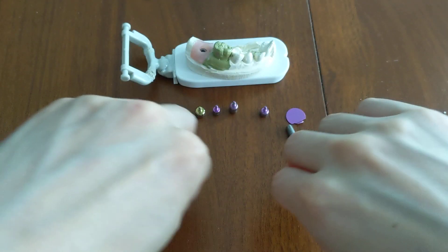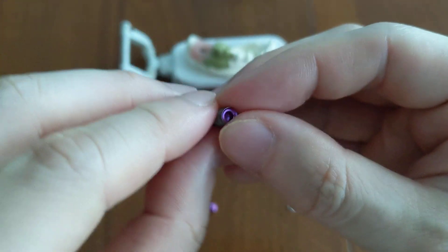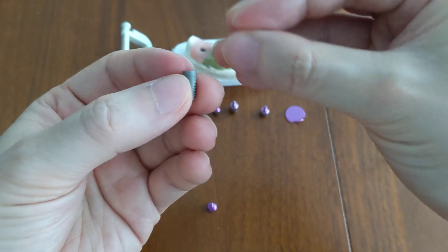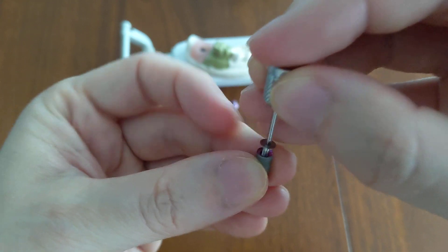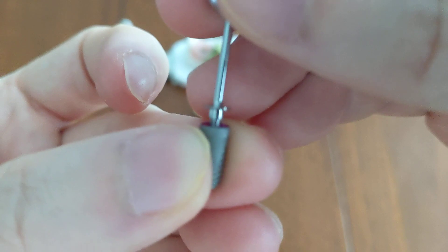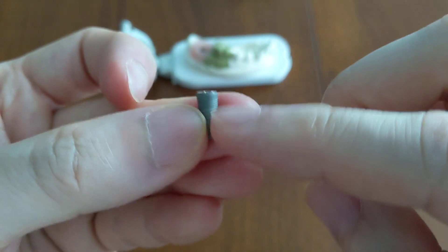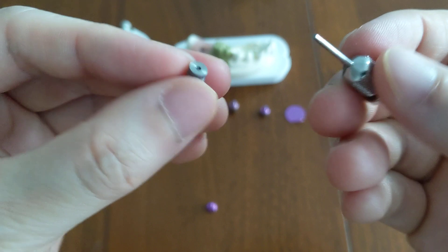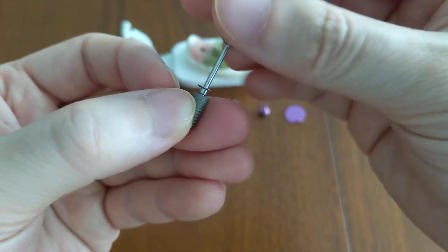Both are placed into an implant — a medical grade titanium screw with a little hole at the top. I'll put the cover screw in first: you just twist it in and it sits pretty flush. It doesn't add any additional height. The top is closed off — the best way I describe it is a manhole cover for the implant, just to prevent things like gums, blood, or food from falling into it.